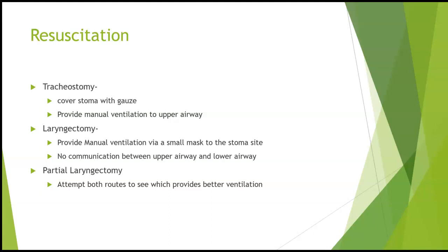Some patients have partial laryngectomies. So in those cases, you want to attempt it both ways and go with the route that's giving you the best chest rise and the most adequate ventilation.